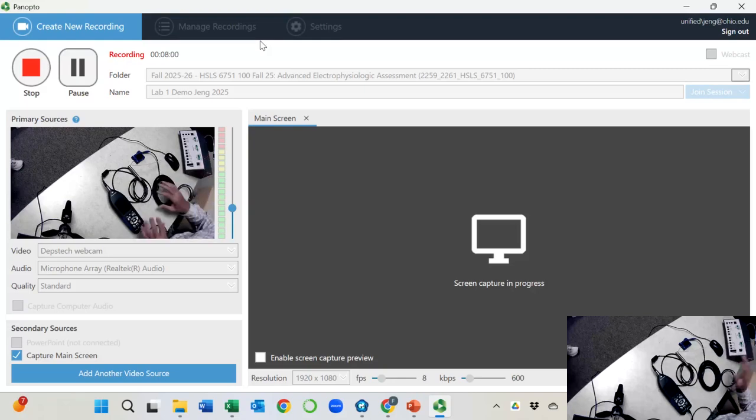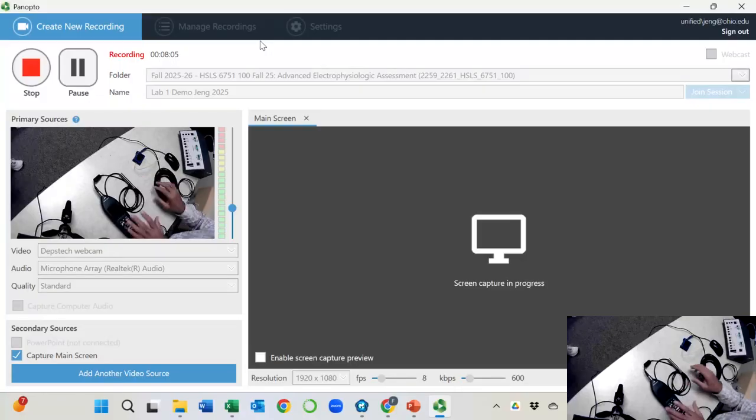Right, so now the audiometer is ready, and the sound level meter and microphone are also ready. But before we can use the sound level meter to calibrate any sound, we have to make sure the sound level meter is not off calibration, because the previous time I used this was probably a year ago or half a year ago for another project. I have to be honest, I used this very often in the early days, but less and less frequently these days. So I need to make sure this is calibrated. How do I make sure of that?